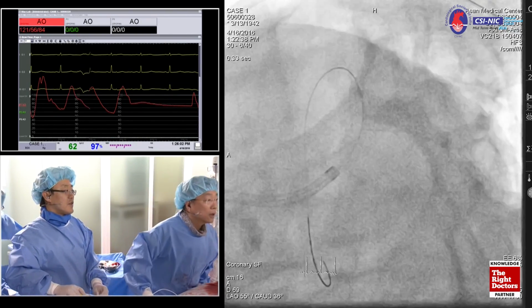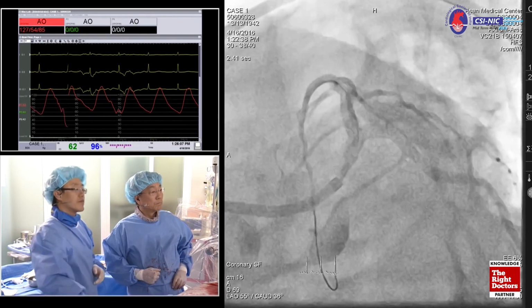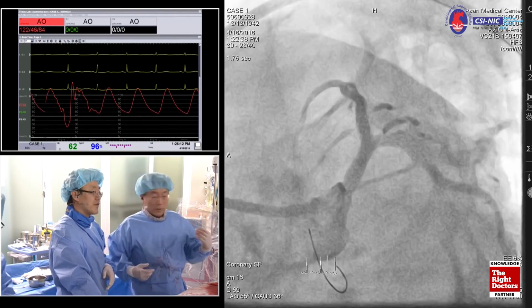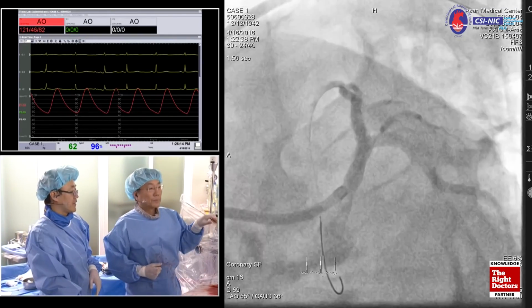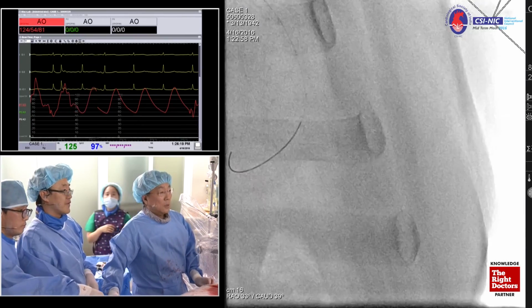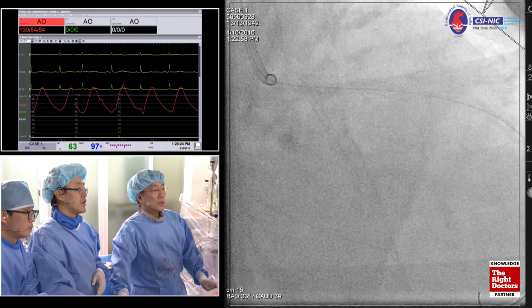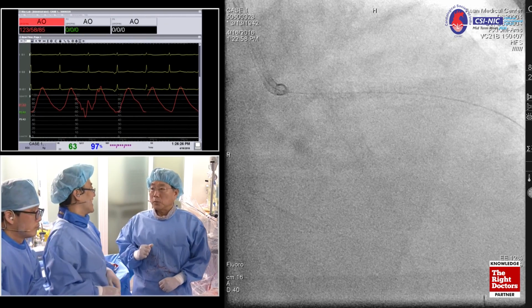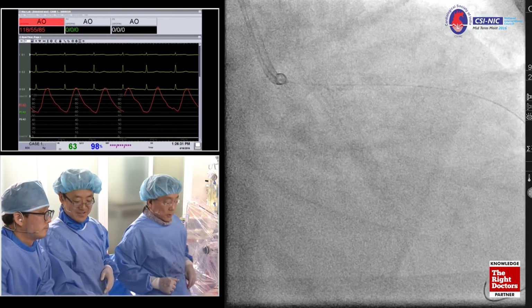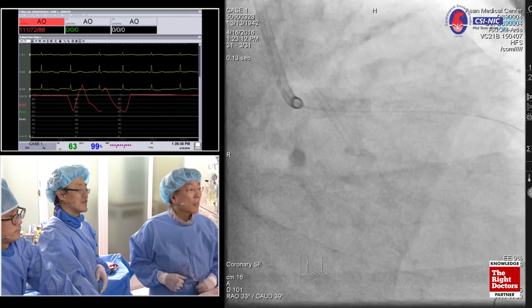What do you think? It looks good in this view. Should we see another view? All right, why not? Are you covered? So, as a next step, the reason for DB: I like Choice PT, I don't like Choice PT wire, right? Sometimes it's not under control. All right, there's another view here. Oh, great. All right, I like it. It looks very good.